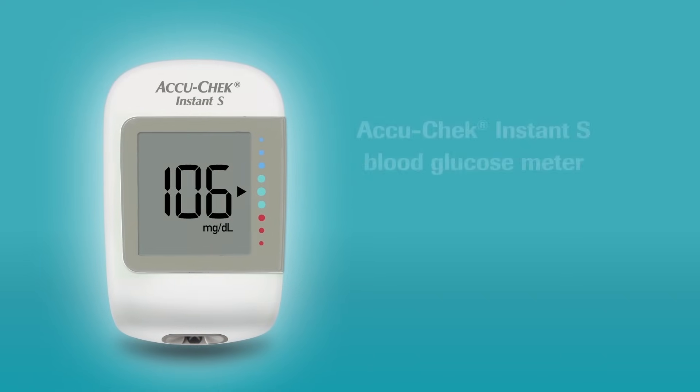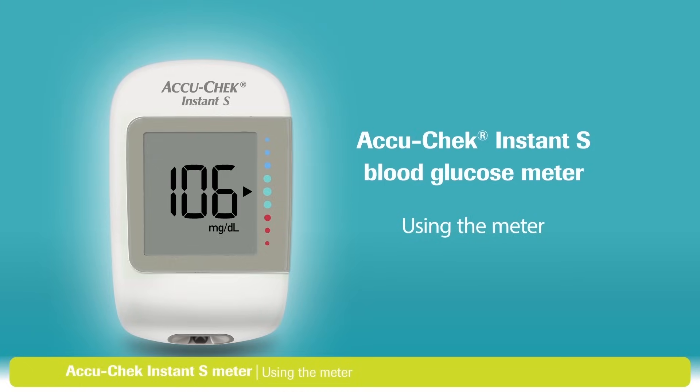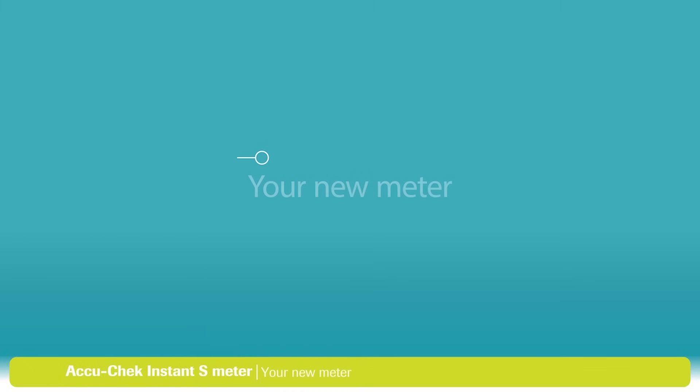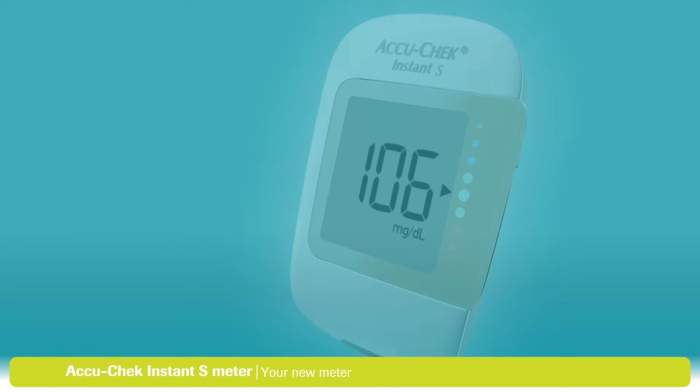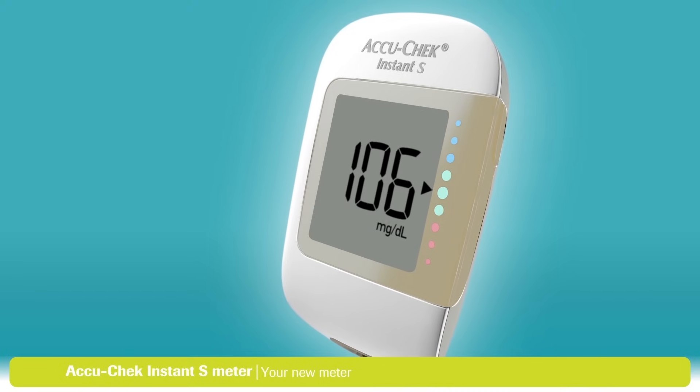In this video, we'll walk you through using your AccuCheck Instant S blood glucose meter. If you're worried about learning the steps involved, don't be. This video is divided into small sections, so if you miss anything, you can always go back and watch that part again.